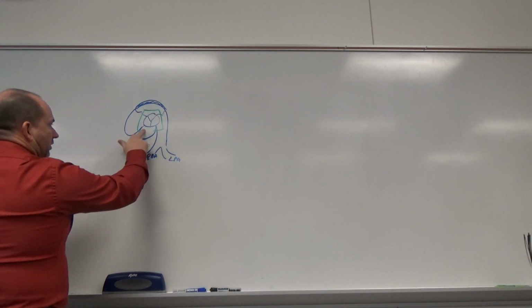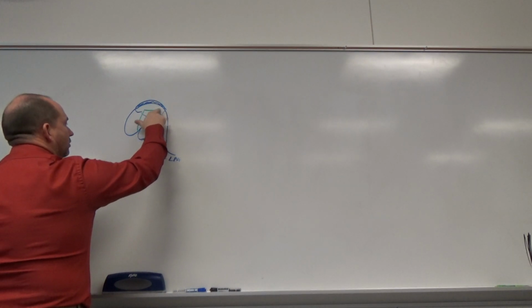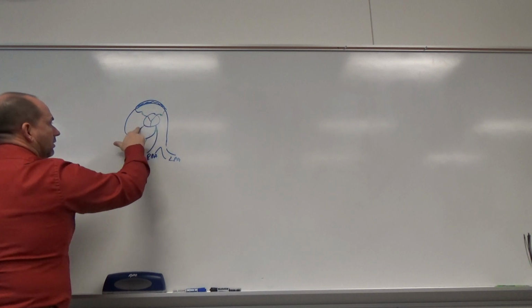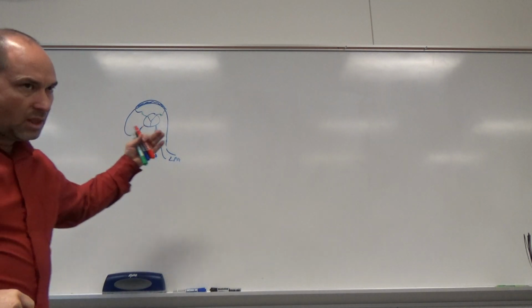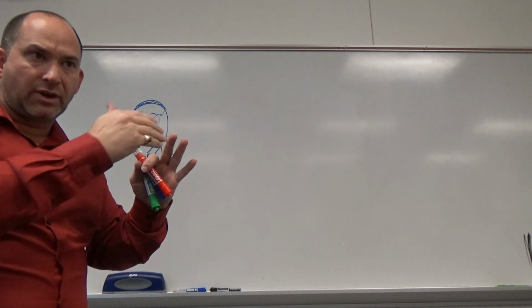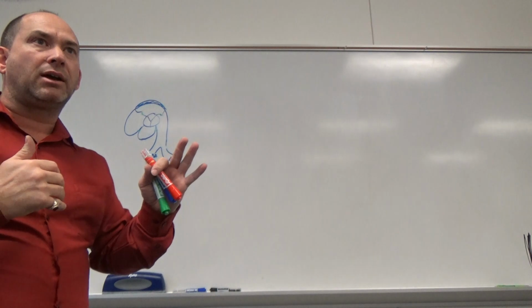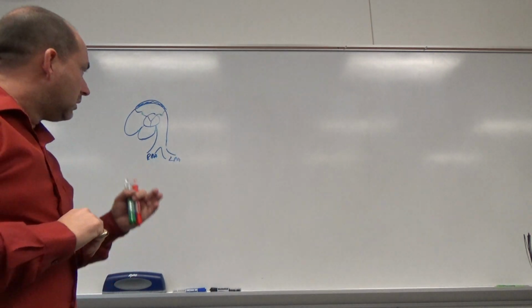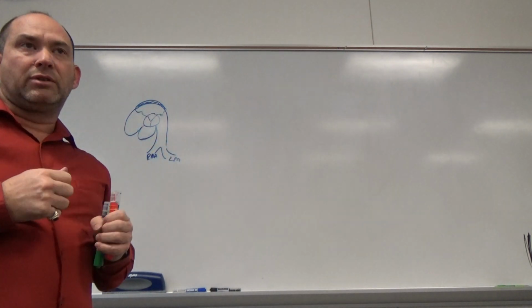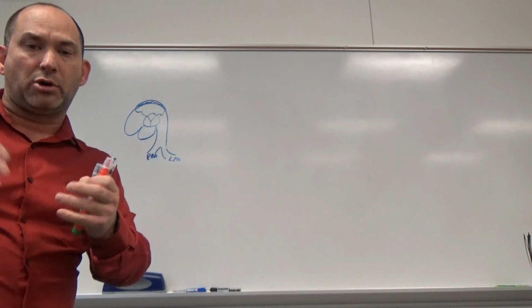So now we'll take this box off, and we'll focus now on, you can do this differently. Tammy and I were discussing if we instead stay in the center structures, so we'll do the aortic valve, and then we'll go through to mitral valve, mid-LV, apex of the LV, and do those in the center first while you have a decent window, and then focus on the tricuspid valve and then the pulmonary valve.